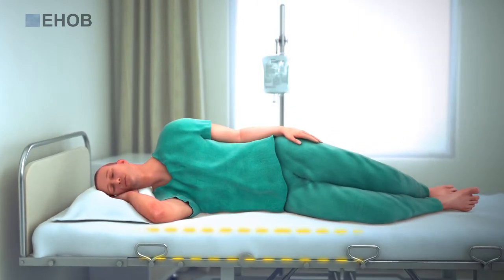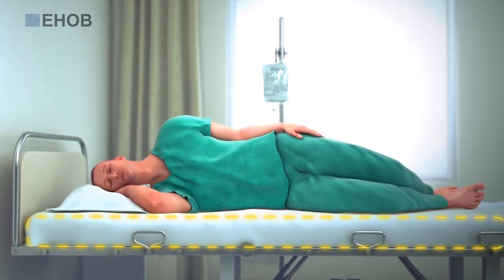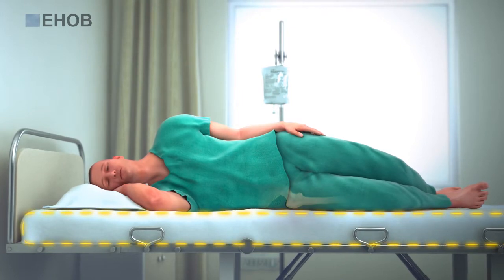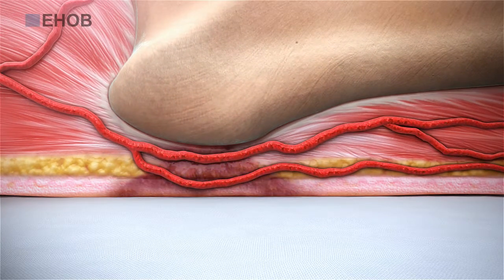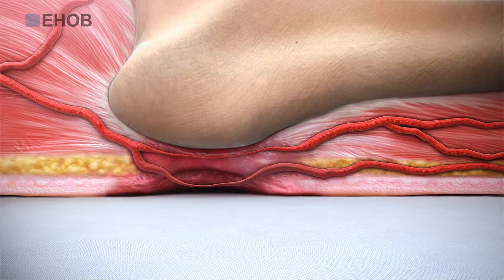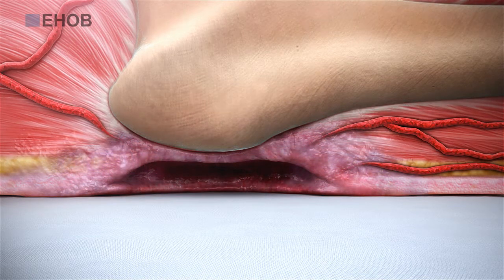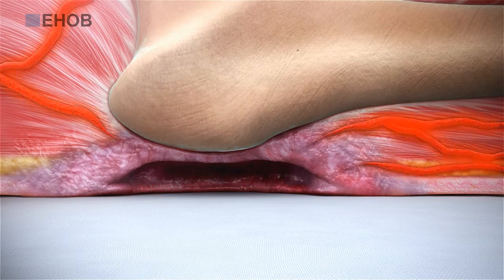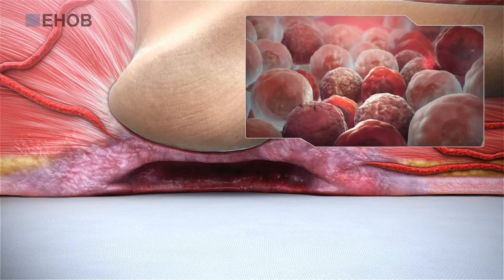Hooke's law of elasticity addresses how the support surface media and container design determines the stress and strain on the human body. On a solid surface, the distortion of soft tissue at risk causes deficiencies in the blood supply to the tissues, cell distortion, abnormalities in the fluid surrounding the cells, disruption in the flow of the lymphatic system, and often a sudden surge of blood supply and oxygen back to the tissue, reperfusion injury, causing the affected cells to die.